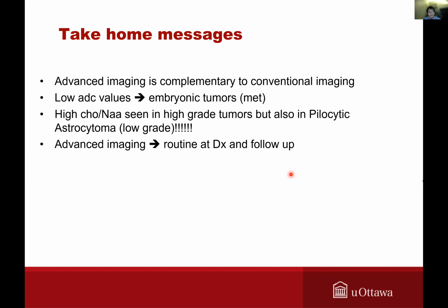And something that I recommend is to try to do non-conventional imaging as part of routine rather than only trying to use it when you have issues, because if you use these kinds of techniques only when you need them, you may not be able to do a proper assessment, because you don't have the routine of doing this post-processing, and there can be many pitfalls, starting from how you place the region of interest, to where you start the curve, where you end the curve, etc.